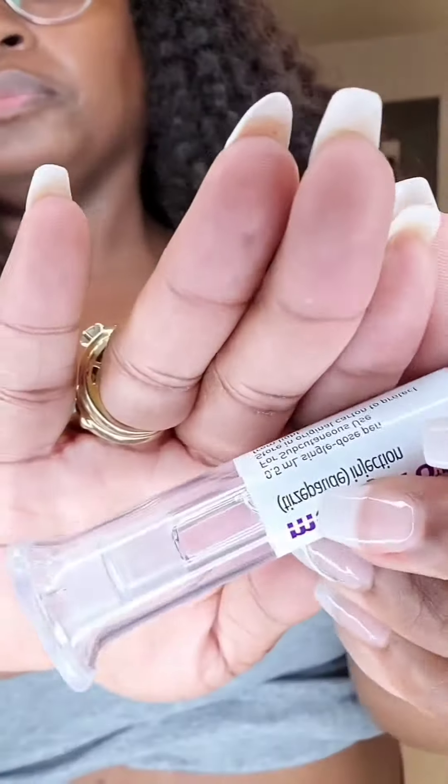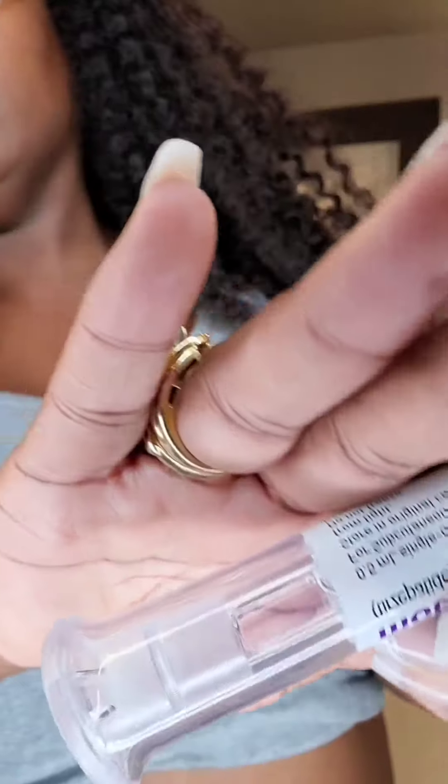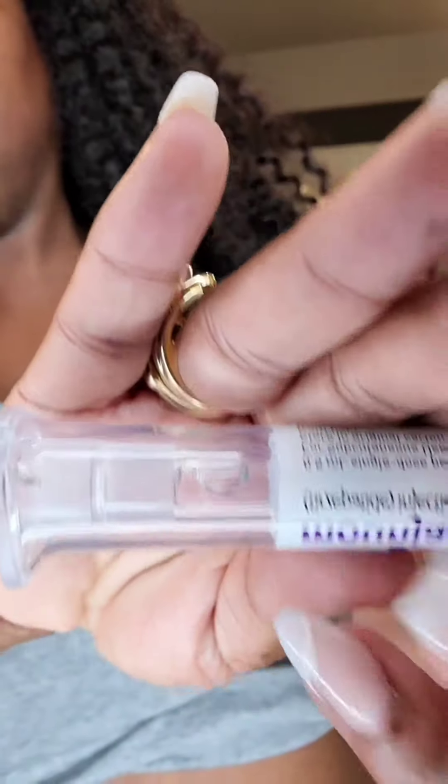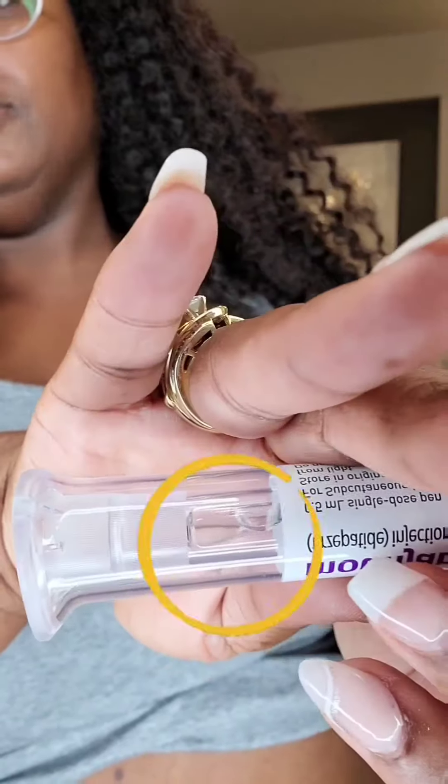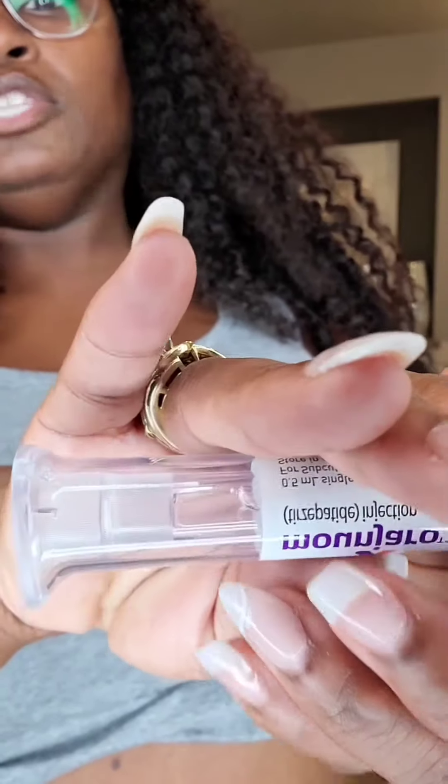I'm going to give my second injection on the opposite side. You're going to push the pin to your belly and hold it for 10 seconds. You can see the medication here — once you see that the medication has been injected, you're supposed to hold for 10 seconds.